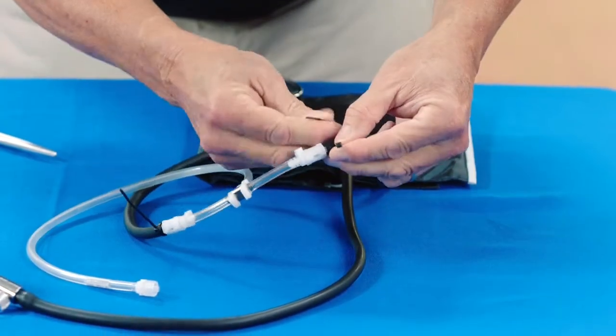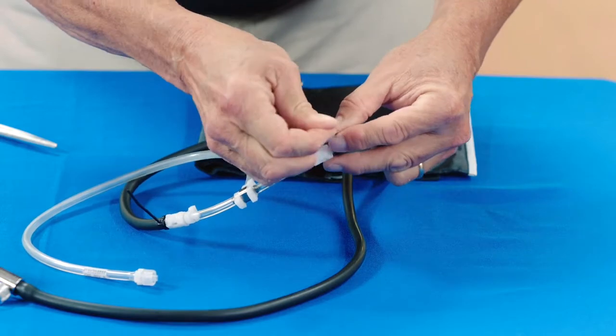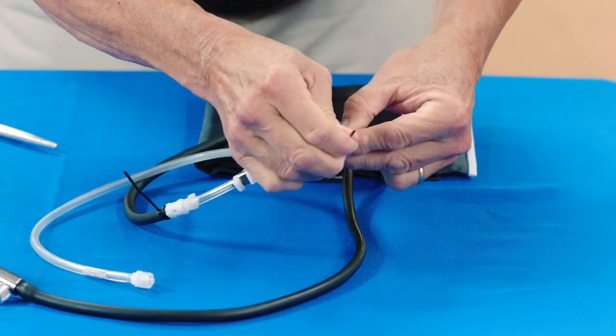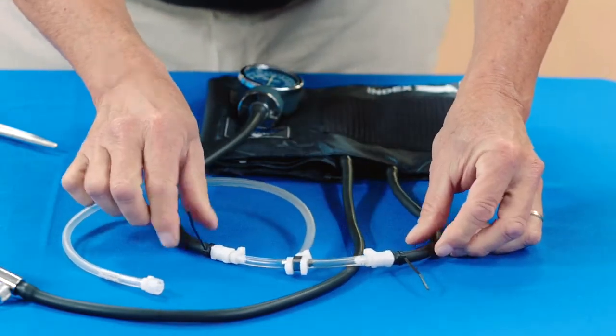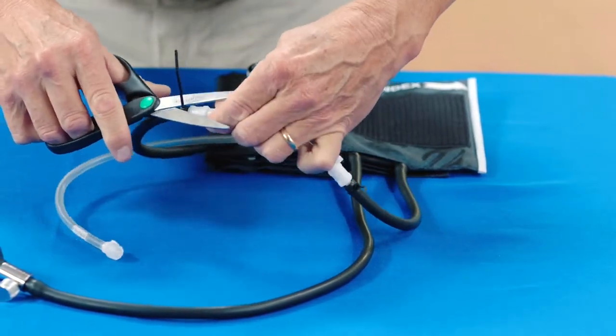Secure the tubing connectors with cable ties. Use the scissors to trim the cable ties.